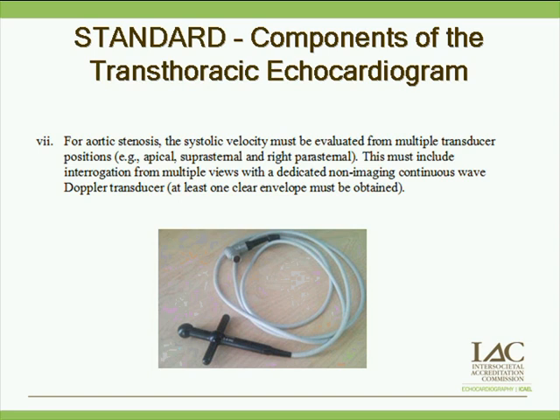from the suprasternal and right parasternal. And this must include interrogation from multiple views with that dedicated non-imaging CW probe. Again, PEDOF, dedicated CW probe, whatever, non-imaging probe, whatever you want to call it, you have to use it, and you have to use it from multiple views, and you have to get at least one clear envelope on your Doppler signals using that PEDOF.